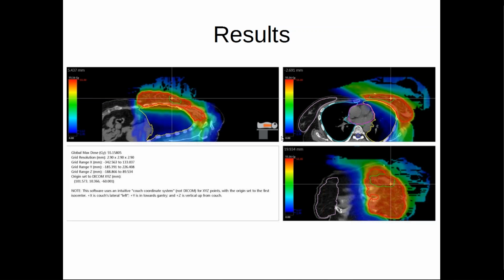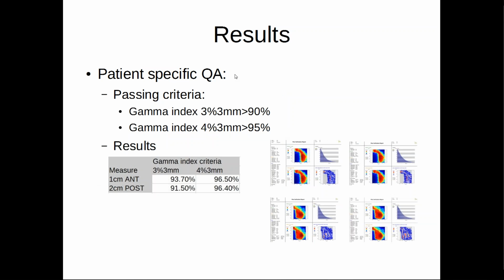So when I did patient-specific QA, I have some major results. It was not the best I had, but it's based on clinical criteria.